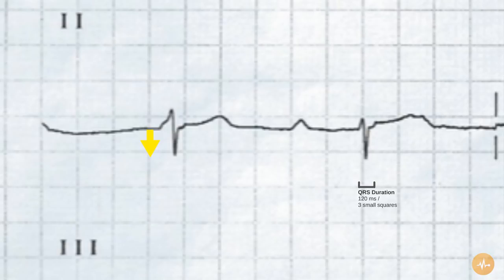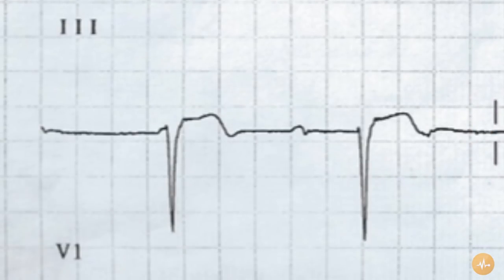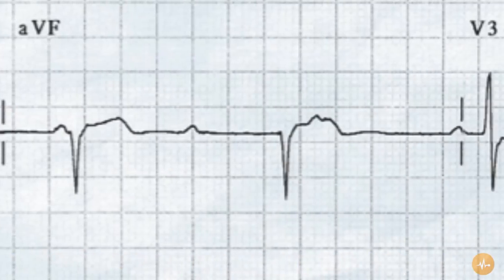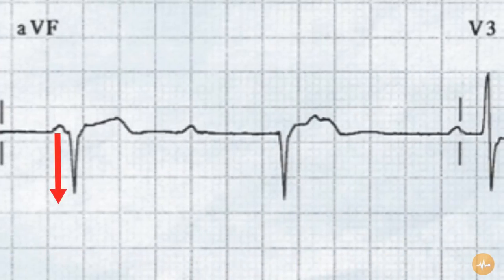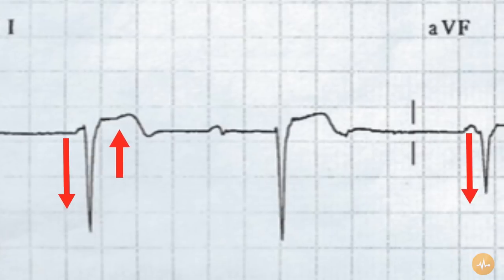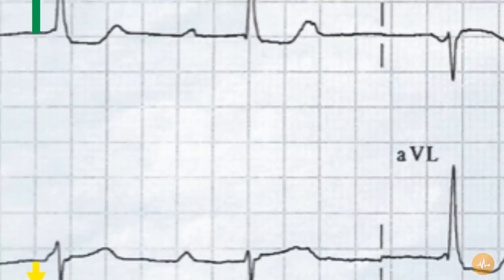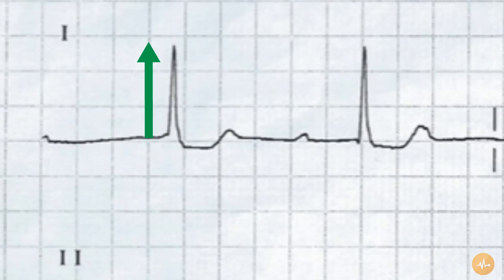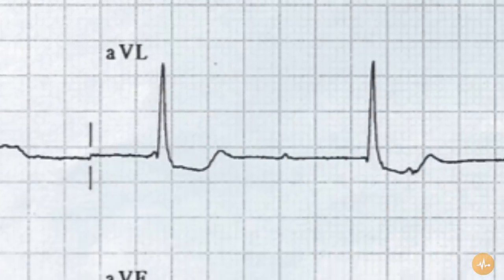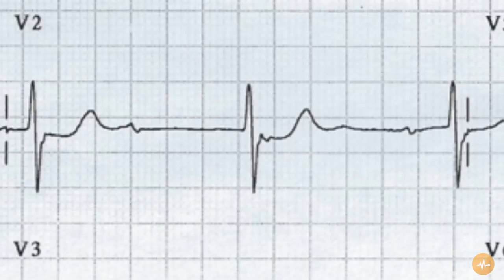There are pathological Q waves present in leads 3 and AVF. There is ST segment elevation present in leads 3 and AVF, and ST segment depression in leads 1, AVL, and subtly V2 and V3.